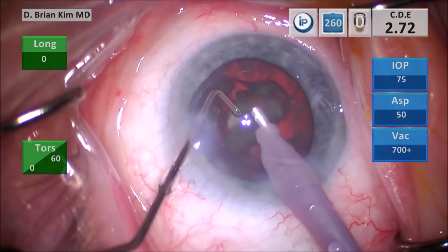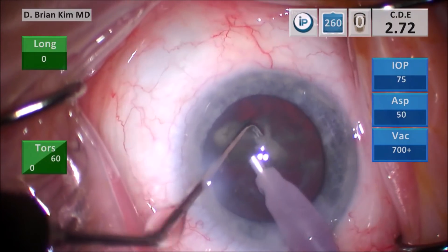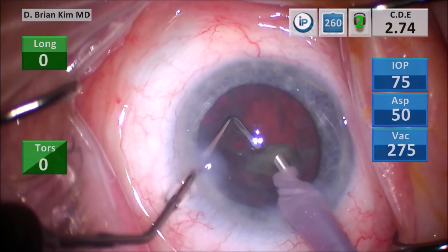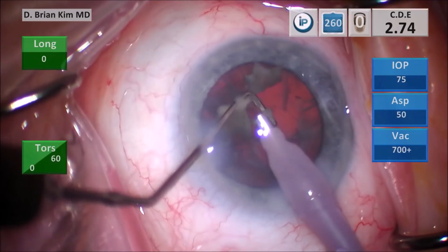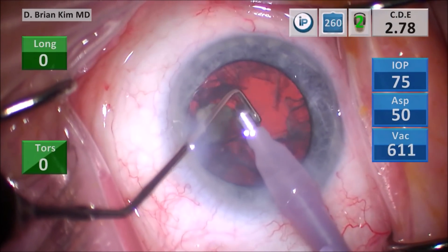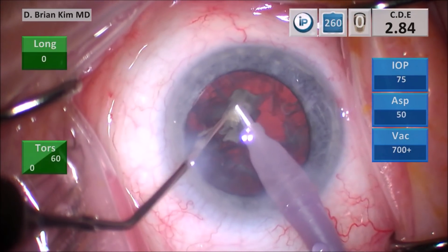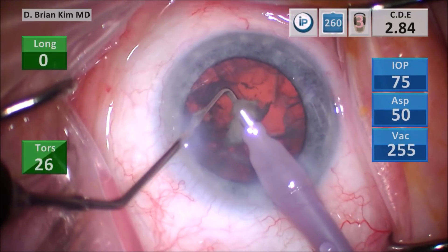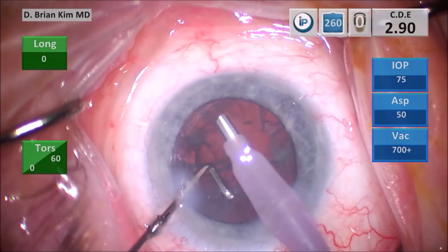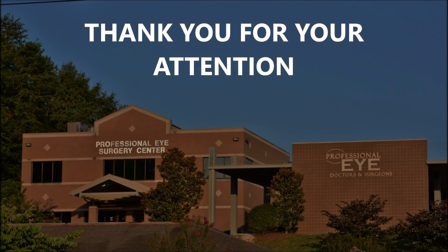Most people would just go after this with vacuum — I don't agree. Go ahead and place the chopper using irrigation only, go around the lens material, and then crush it. Minimizing the use of ultrasonic energy and vacuum is inherently safer because those two things can cause problems. You can certainly go after these pieces with high vacuum, but vacuum can cause a posterior capsule rupture. If you can just use mechanical fracturing forces to crush these last pieces and then emulsify them as you go, this is really a safer way — you're reducing ultrasonic energy, which protects the cornea, and you're not using as much vacuum, which also protects the posterior capsule. In this series, I'm going to continue to show different cases highlighting mechanical fracturing and showing the power of this technique. I hope this was helpful to you, and thank you for your attention.